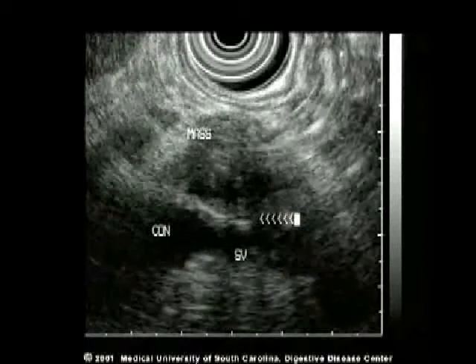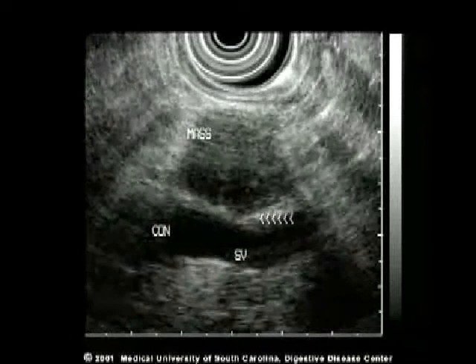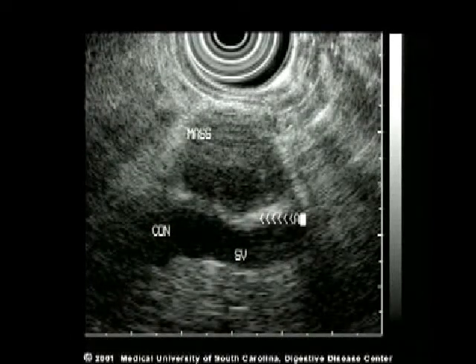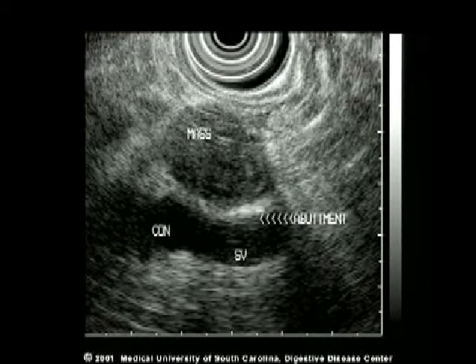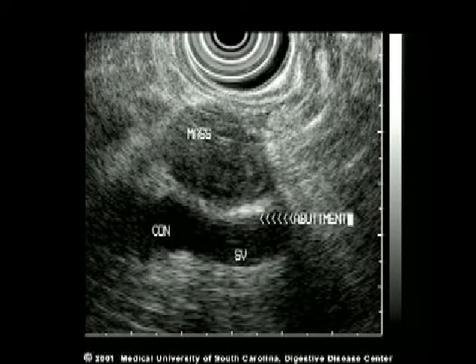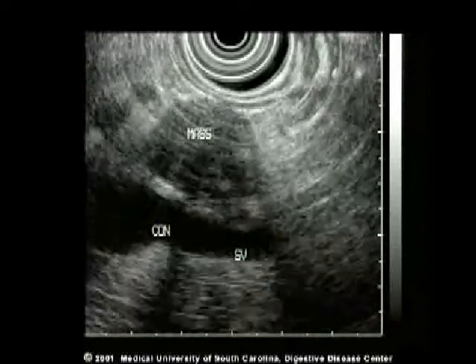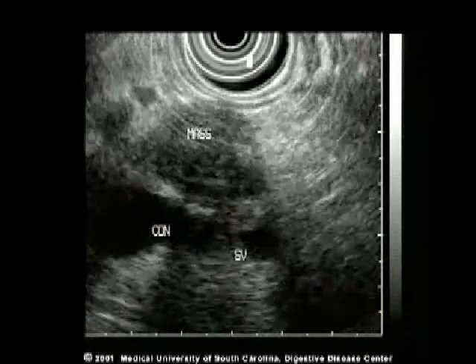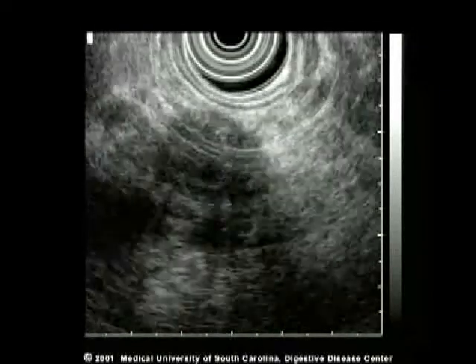Note that a plane can be seen between the mass and the splenic vein. Although this tumor abuts against the splenic vein, there is preservation of an echo plane between the vessel and the tumor. The transducer is carefully moved to both sides of the tumor, to the left and right, and has also been advanced forward and backward to make sure that there is no evidence of vascular invasion.